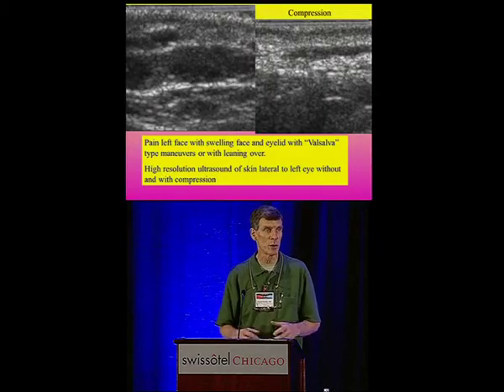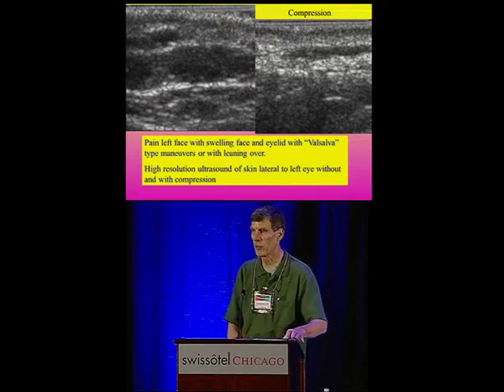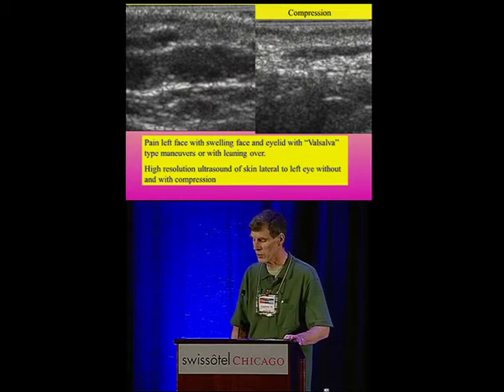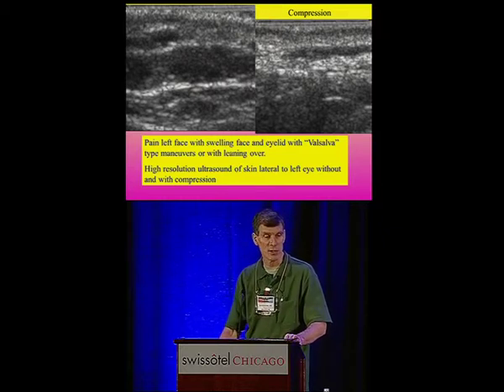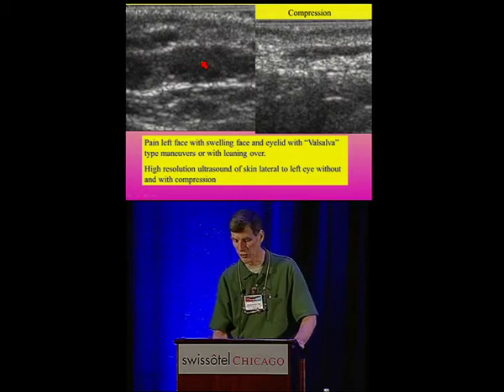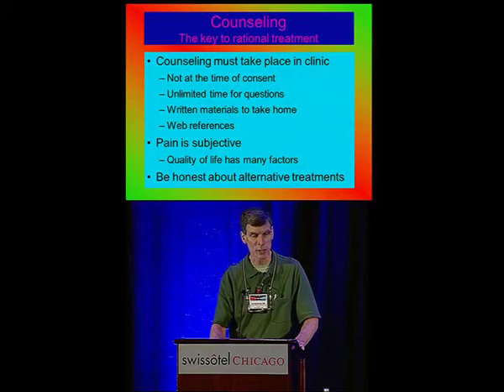We always, when we're doing the ultrasound exam at the time that we do the ultrasound-guided treatment of low-flow malformations, particularly the venous malformations, we always do it with compression so that we can see that this big dilated vessel completely collapses below this non-collapsing sort of neurovascular bundle of some sort. And as long as that's happening, we know we can poke into here and inject that with freedom, and we'll see the injection in just a little bit.